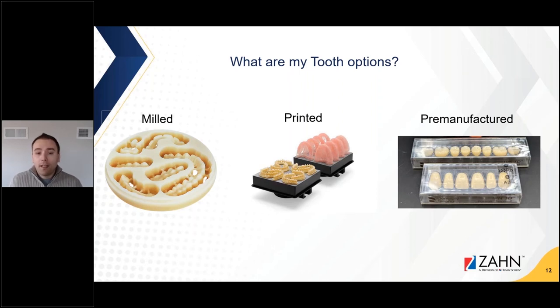And again, the main benefit, aesthetics. It is the most aesthetic denture tooth out there available, anything from carded teeth. It doesn't just have to be Dentsply, there's a million out there, and they're all pretty great actually.